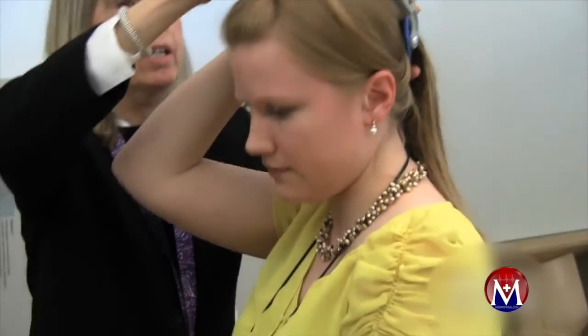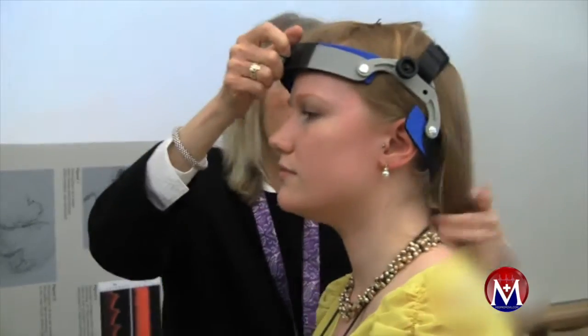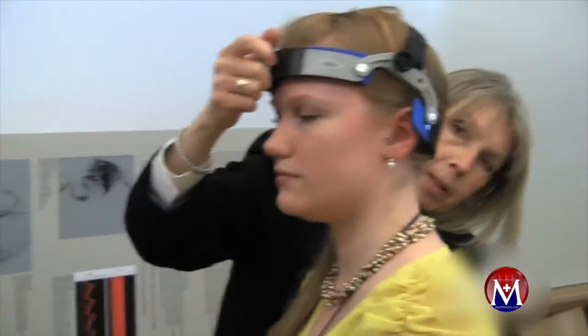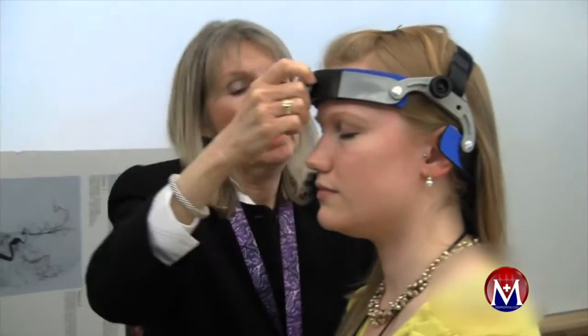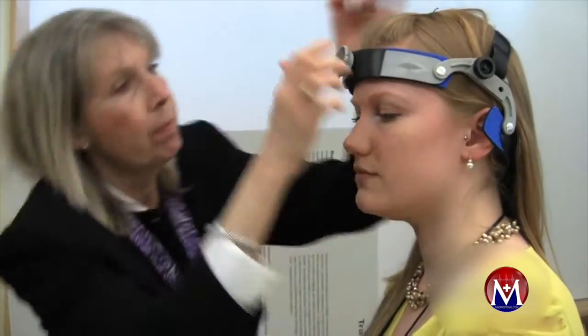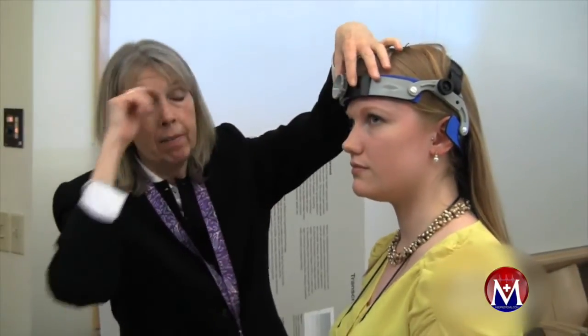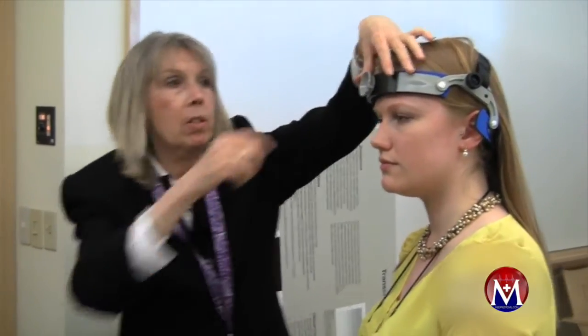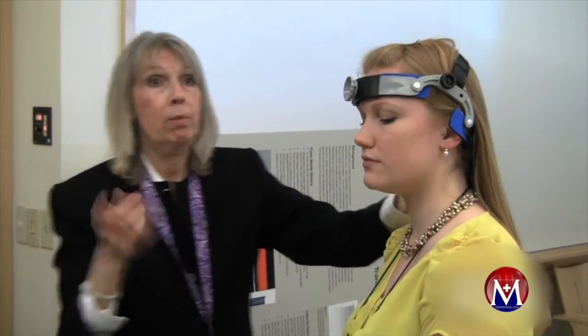For patients with long hair, put the head frame on and pull the hair back. You want that to be below the occipital bun, then check that you have plenty of access — and on this patient you do. If this was a patient I was seeing for the first time, it might be a good idea to find their windows first before putting the head frame on, so you have an idea where they are and don't cover them up.